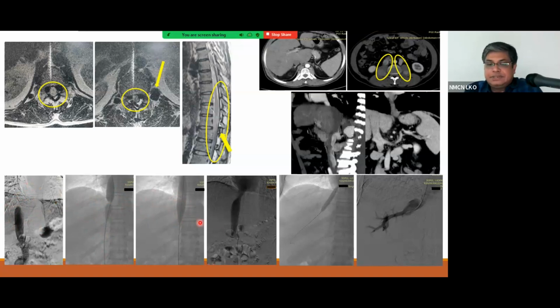Balloon dilatation was done, and post-angioplasty, we can see excellent restoration of antegrade flow from IVC to heart with disappearance of the collateral channel. As the patient also had partial stenosis of the RHV, angioplasty was done, and we can see antegrade flow via the RHV.